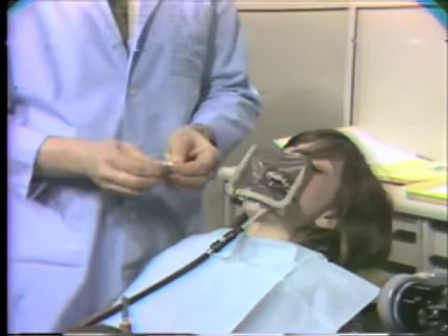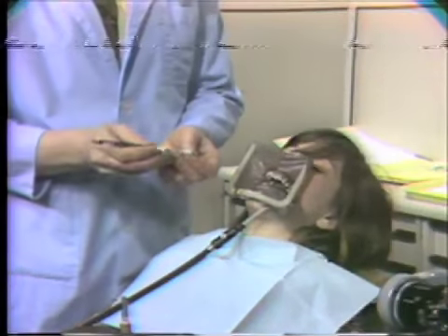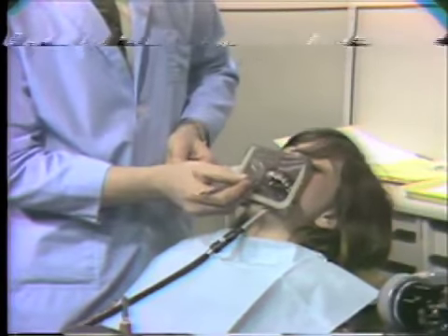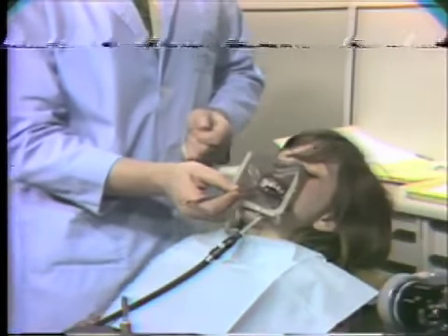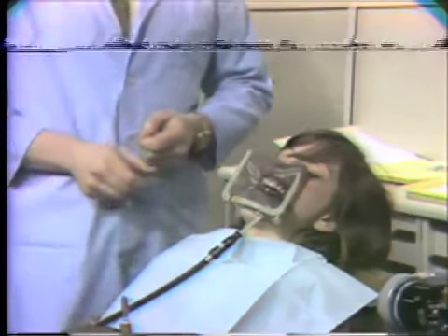Now the next thing I'm going to do is break up a cotton roll. Take small pieces of cotton that I can form to the size of the labial surface of each tooth. And it's these little pieces of cotton that will ultimately saturate in superoxol. Now, before I apply any superoxol to the tooth, let me have you listen to the instructions I'm going to give Carolyn. This is important.